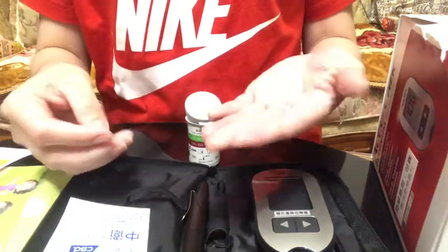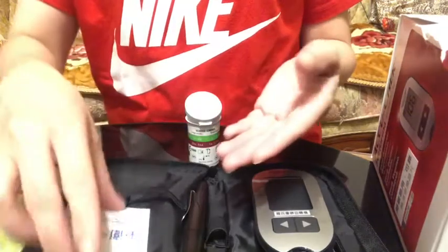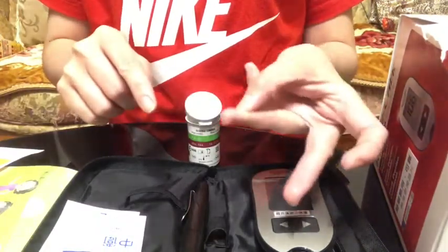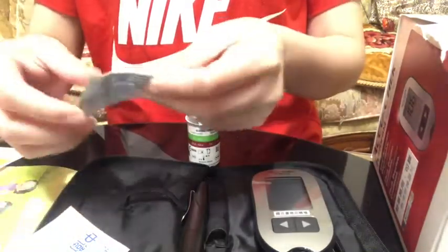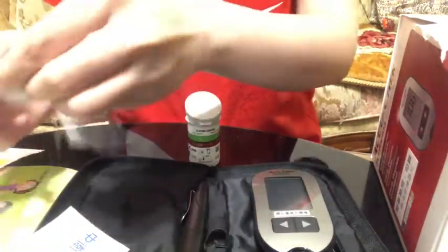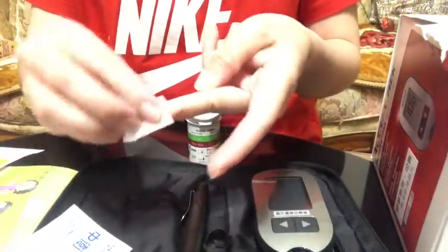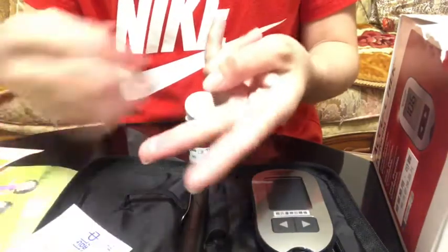Use different fingers for each test. For example, I will choose this finger. Clean your testing site and let it dry.